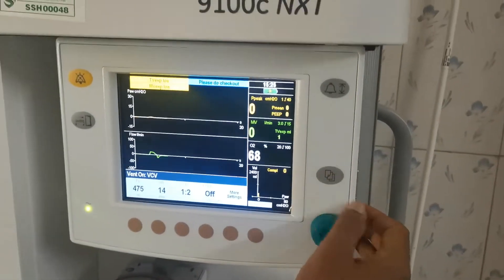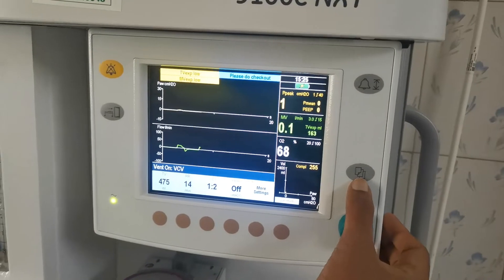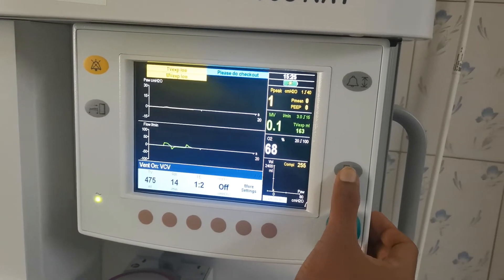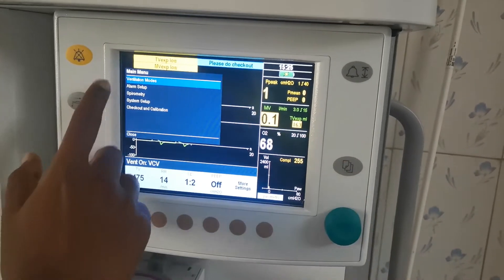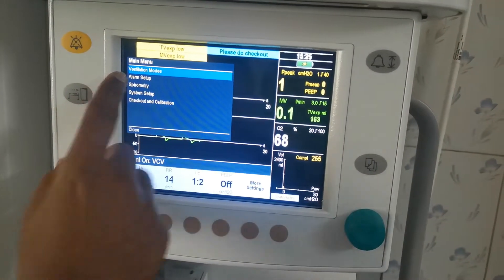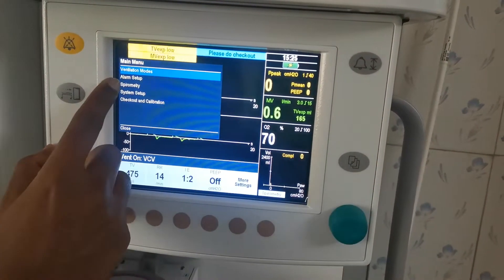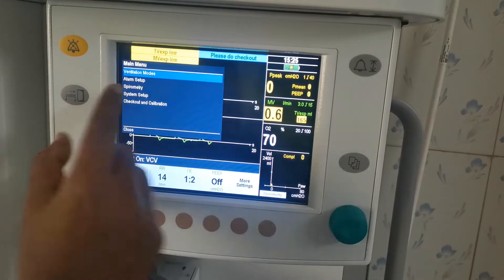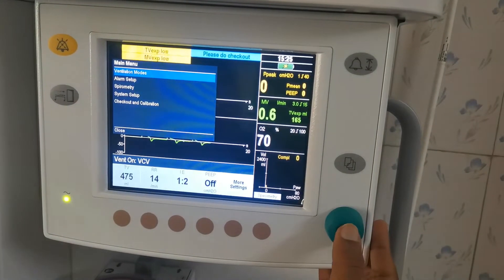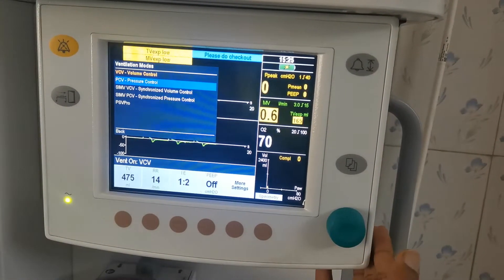Then you can go to the menu. This is the menu button. You can go to the menu — you have ventilator modes listed there. You select the modes.